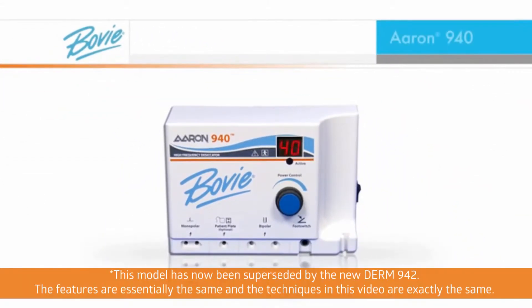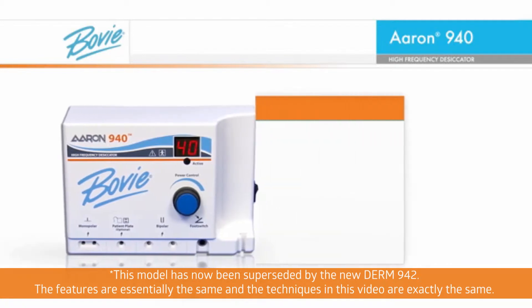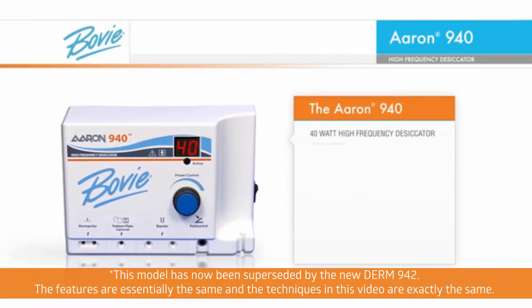The Aaron 940 is a refinement to the office-based electrosurgical products used in desiccation, fulguration, and coagulation. Bovie's 40-watt high-frequency desiccator forever removes the need to go through a tedious multi-step process to change from low to high power.